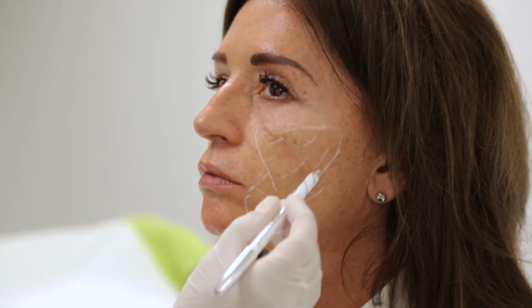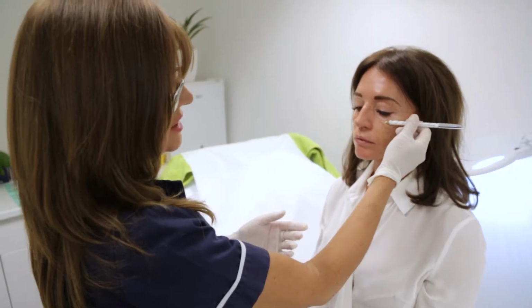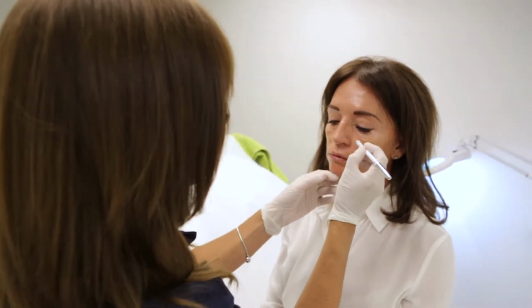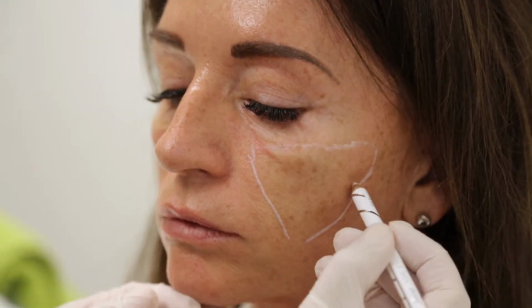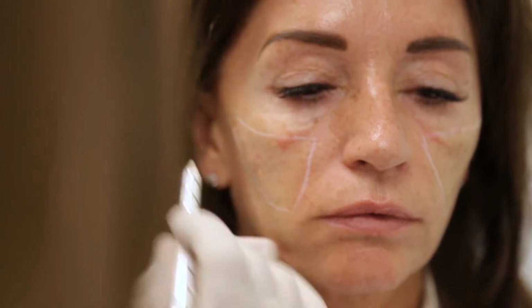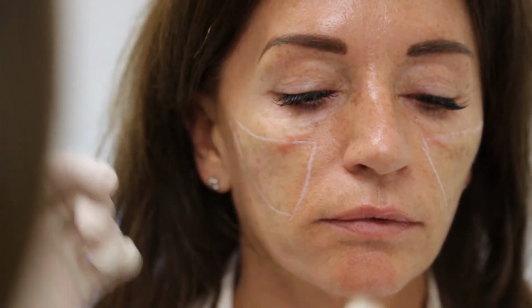What we want to do is mark out the areas where we want to treat. As you can see, the left side on this area here is slightly deeper than the right side. So I want to concentrate a little bit more on this area here. So what I'm going to do is mark out where I want to inject. We don't need the area symmetrical because obviously the volume that's been lost is not the same on both sides. So I'm going to start from the cheek area here and work my way.